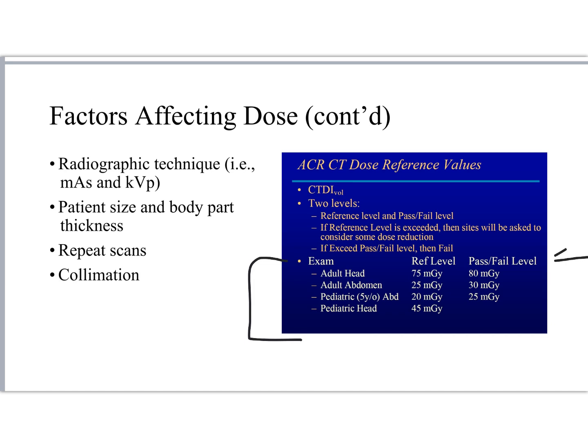The technologists and the radiologists are working together to define, okay, this is what we would expect to see for most all scanning. If we see it go beyond that, then we need to notify a physician prior to initiating the scan. I think this is a really good way to view dose. I think it could also guide dose reporting.